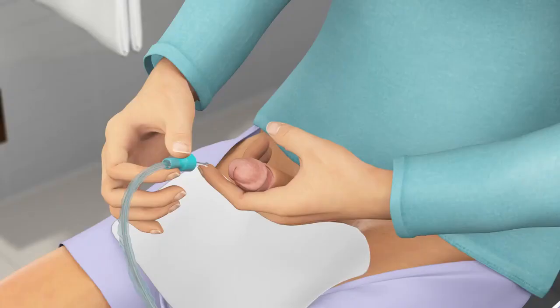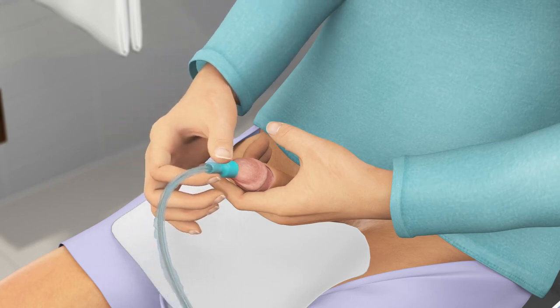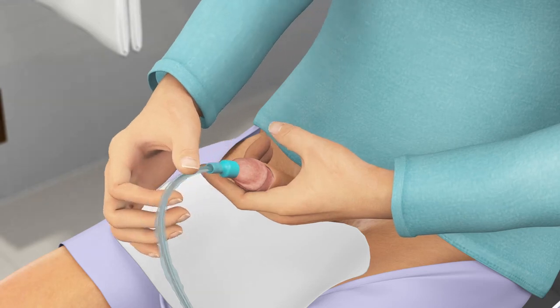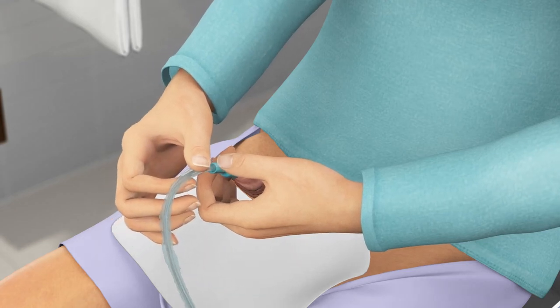To help insertion, it's important that you relax. While supporting your penis with your non-dominant hand, guide the tip of the catheter into the urethra with your dominant hand. Once the tip is inside the urethra, use your non-dominant hand to grip the soft part of the turquoise handle so you now hold your penis and the turquoise handle in the same hand. Press the handle gently to hold the catheter in place.